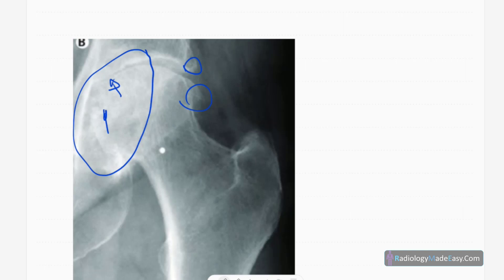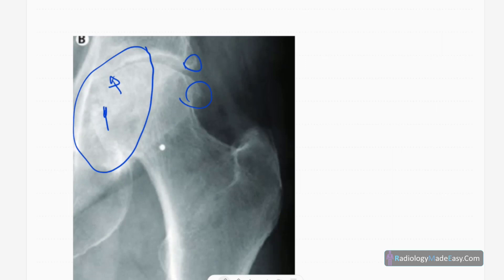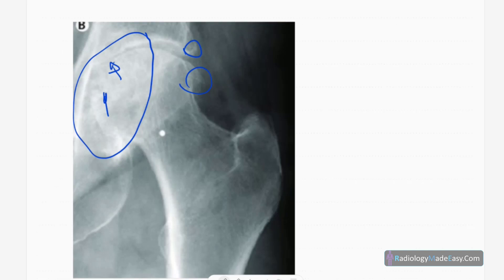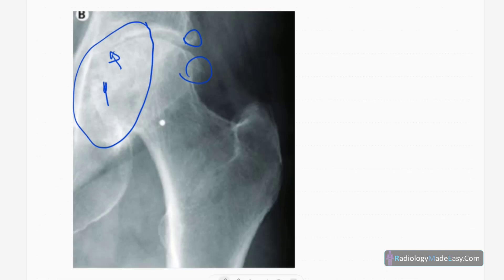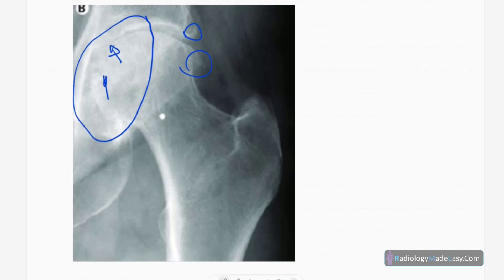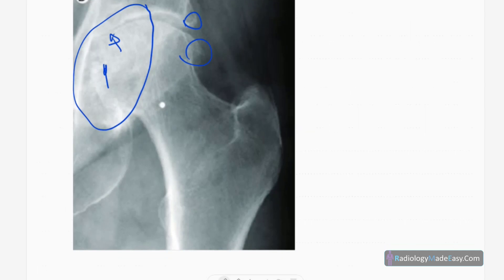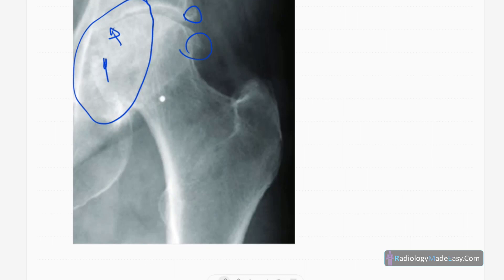This is the anteroposterior radiograph of the hand. You can see distal interphalangeal joint involvement with marked joint space narrowing. The metacarpophalangeal joints and proximal interphalangeal joints are relatively spared.